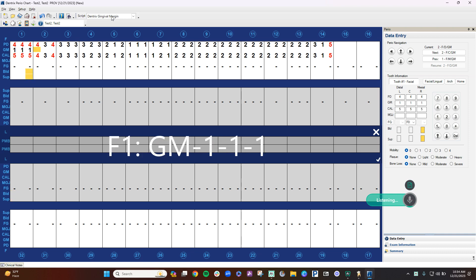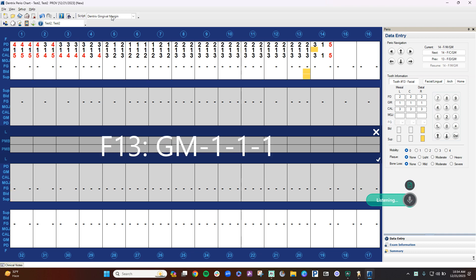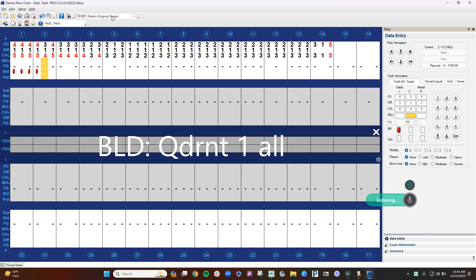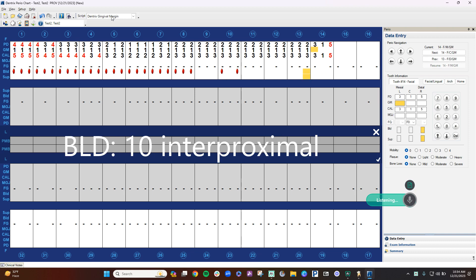Bleeding quadrant 1, all, bleeding 10, interproximal, bleeding 11, all.